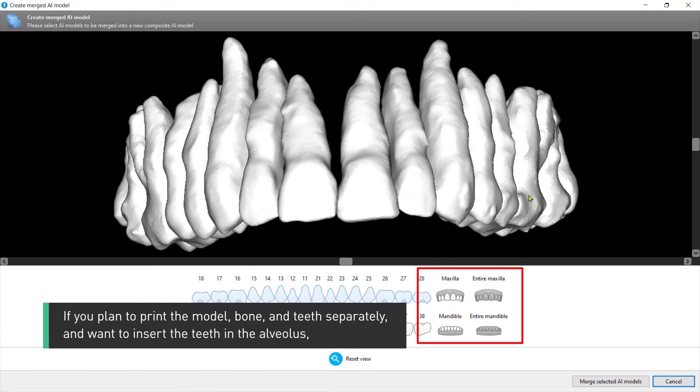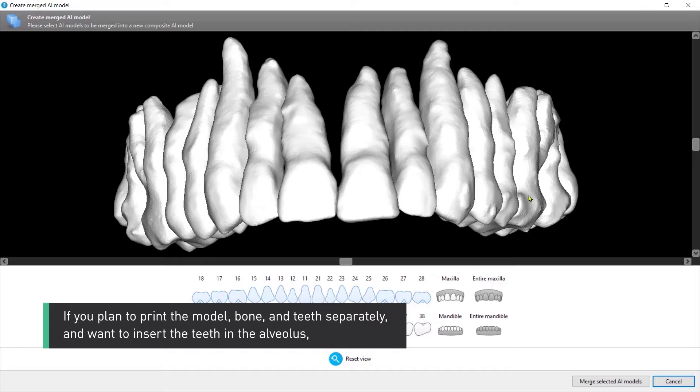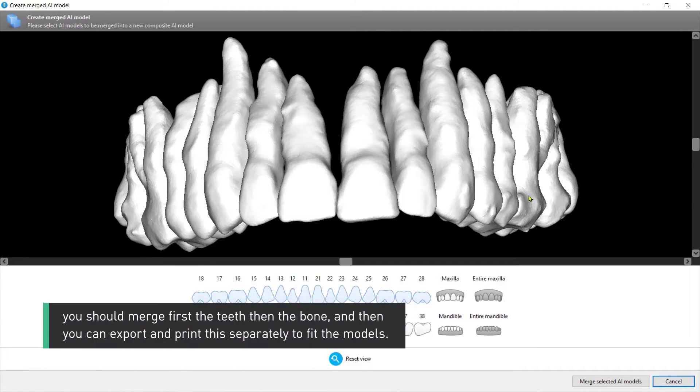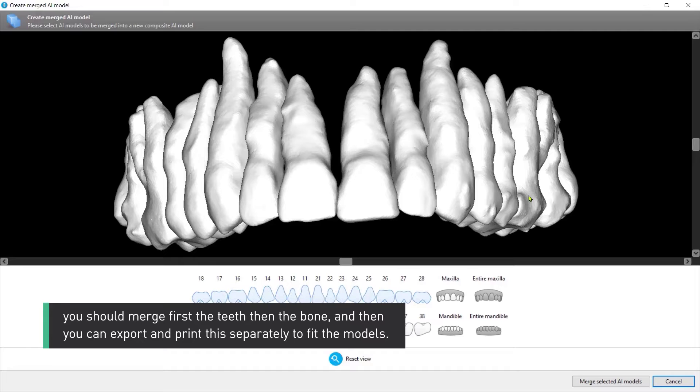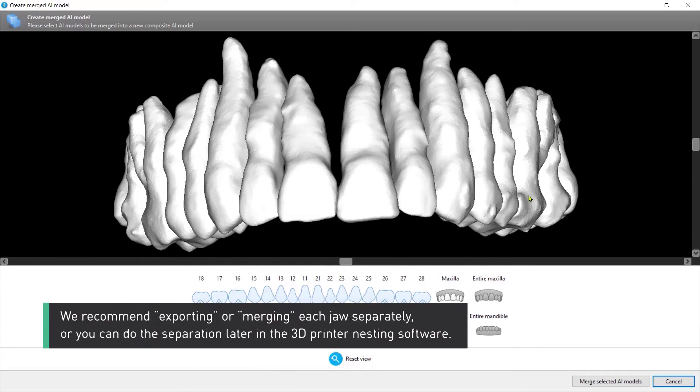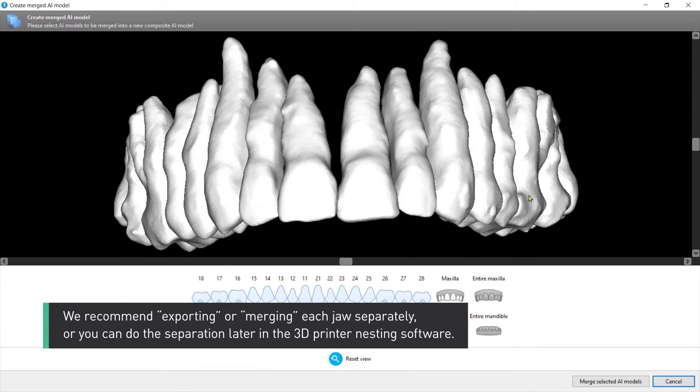If you plan to print the model bone and teeth separately and want to insert the teeth in the alveolus, you should merge first the teeth then the bone and then you can export and print this separately to fit the models. We recommend exporting or merging each jaw separately or you can do the separation later in the 3D printer nesting software.